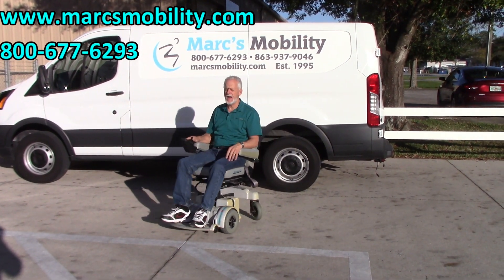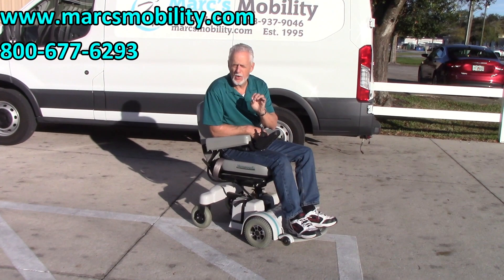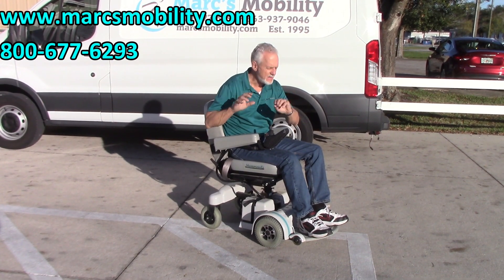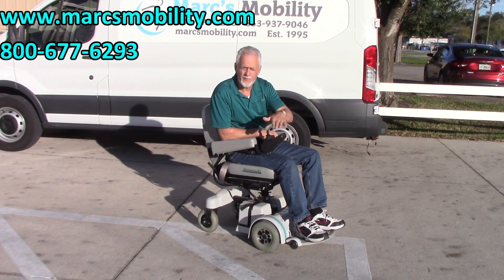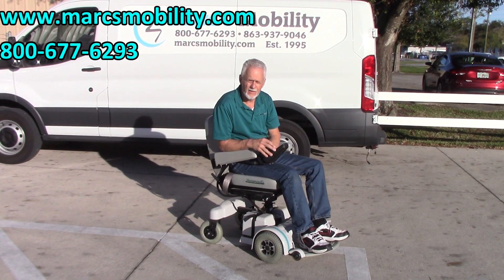This is the Hover-Round MPV5. Top speed is about 5 miles an hour. The motors are a little bit noisier because these are heavy-duty motors, so there's a little bit more of a hum — that's normal with these heavy-duty motors. This is the one with the 5-inch seat lift, really smooth, no problem through the grass, ready to go.